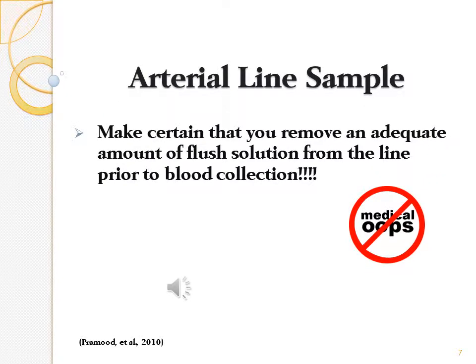Again, in the PACU, we have a lot of arterial lines, and that's mostly the way that we obtain our arterial samples. One of the most common pre-analytic errors is having too much flush solution in the tubing before you draw your sample.